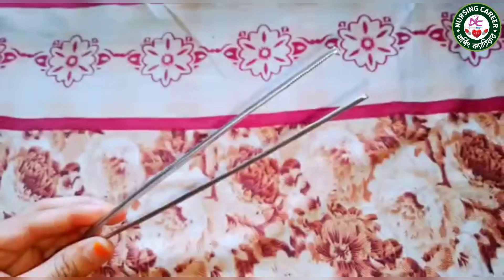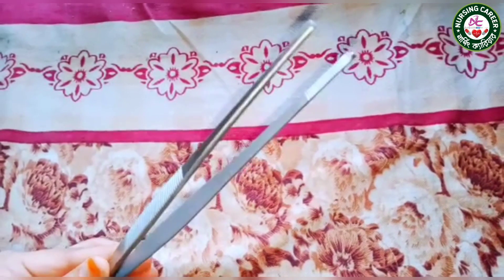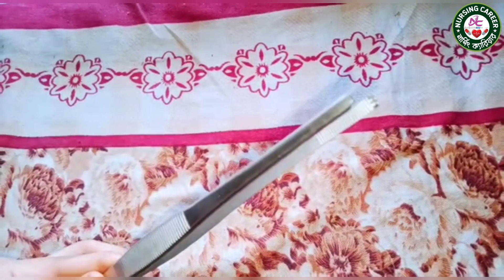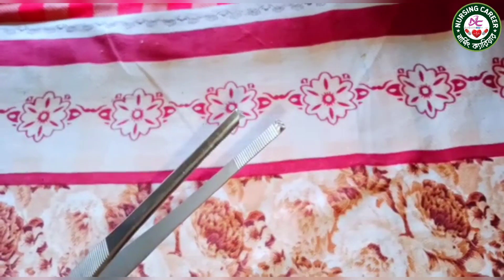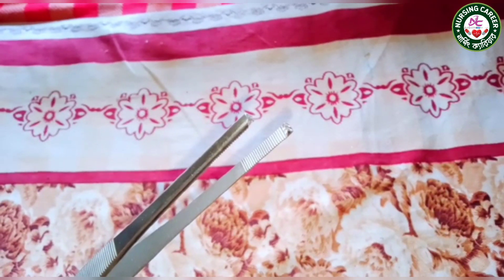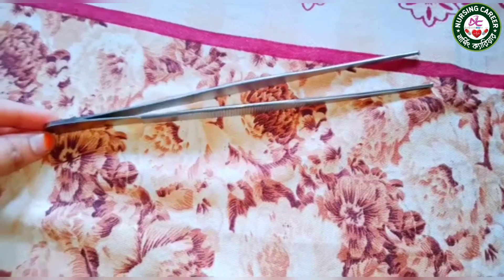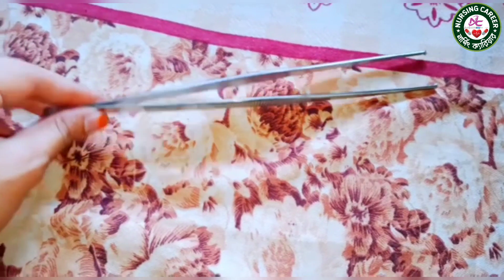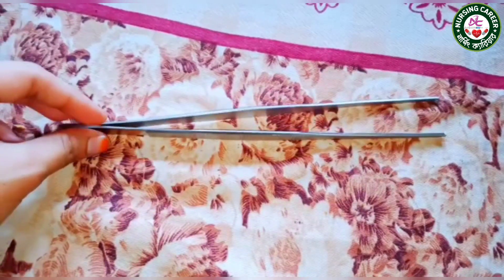This is tooth dissecting forceps. It is used to grasp or hold soft tissues during surgery. This is soft tissue.